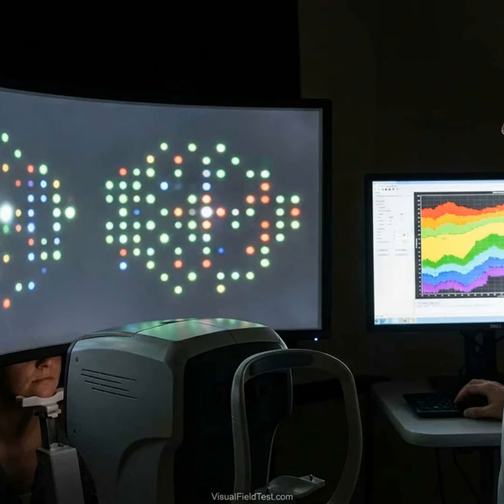Early glaucoma often affects these small bistratified cells, so SWAP can reveal field loss sooner than conventional testing. Indeed, studies report SWAP can detect visual field defects in glaucoma suspects or early glaucoma eyes before standard perimetry shows losses, suggesting higher sensitivity for early damage. For example, one study found SWAP deficits strongly correlated with retinal nerve fiber thinning in the inferior quadrant in glaucoma patients, indicating SWAP loss matches structural damage.